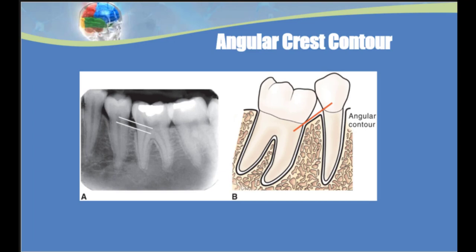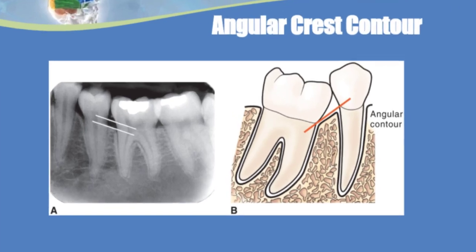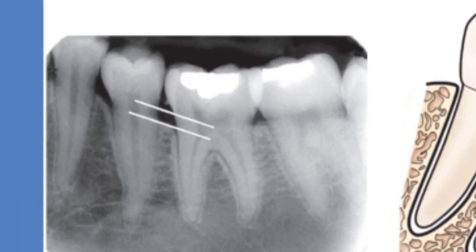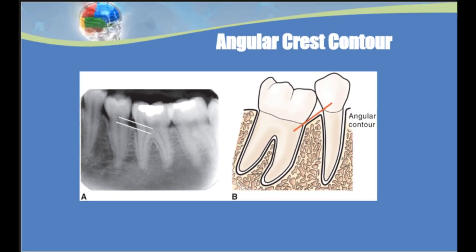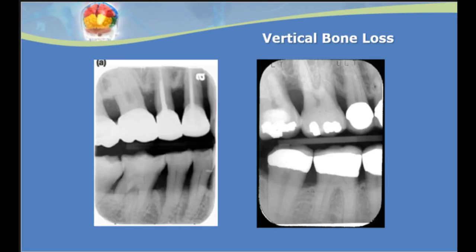The alveolar crest can also be healthy with an angular contour. When we look at an example with an angular contour, we may first assume there is bone loss. But if you draw an imaginary line from the CEJ of number 20 to the CEJ of number 19, we see a natural angle in the alignment of these two teeth and therefore a natural angle in the alveolar crest. The important takeaway is to always draw the imaginary line between the two adjacent CEJs before assessing the alveolar crest.